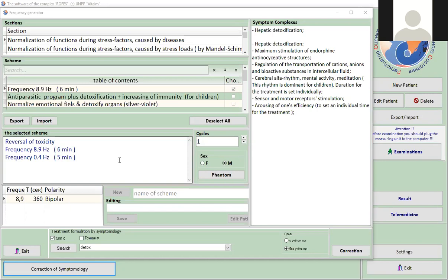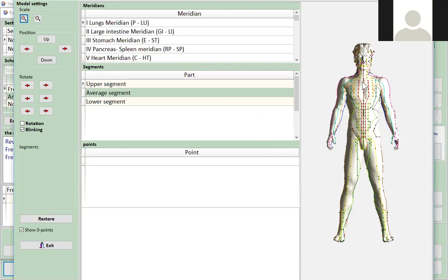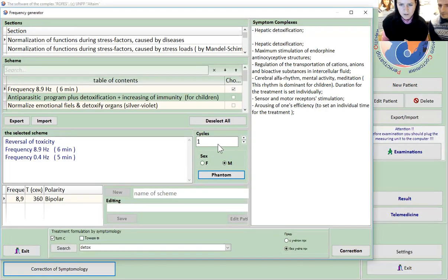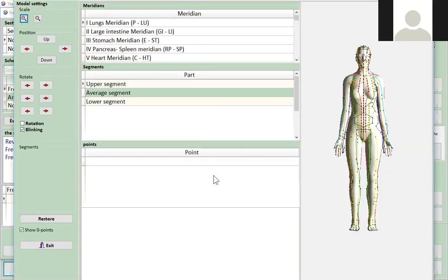You're welcome. I have a question about the screen that's up. What happens when we press where it says phantom, below the sex part? It's female and male. But phantom? This just shows you the body where it is making the points. Okay. And so if we press female, then the body would come up as a female body. I pressed, I think, male, but now female. Yeah, it will be a girl. Okay, thank you. Welcome.